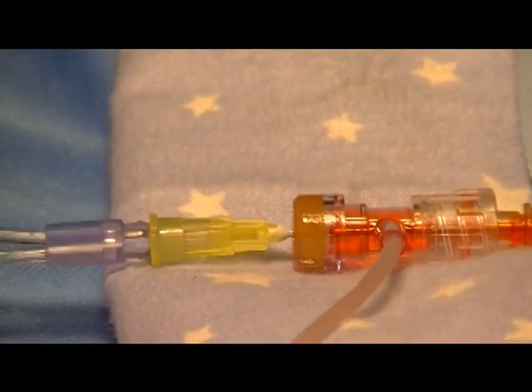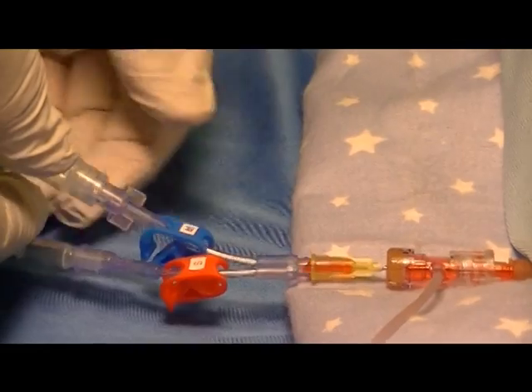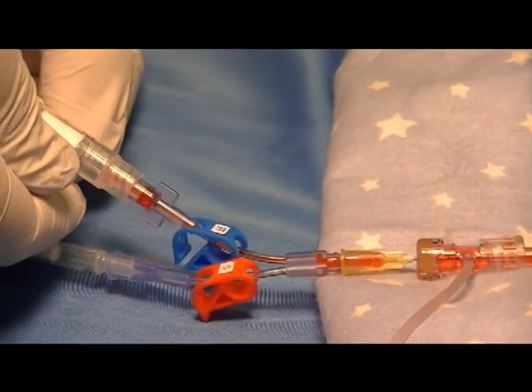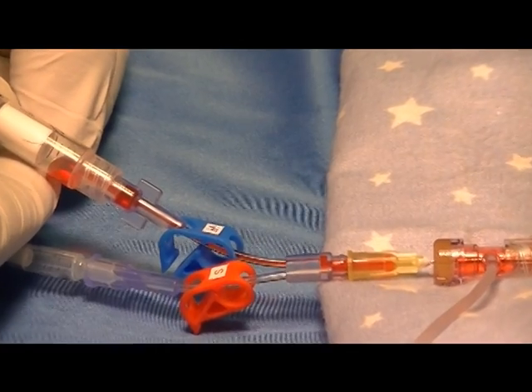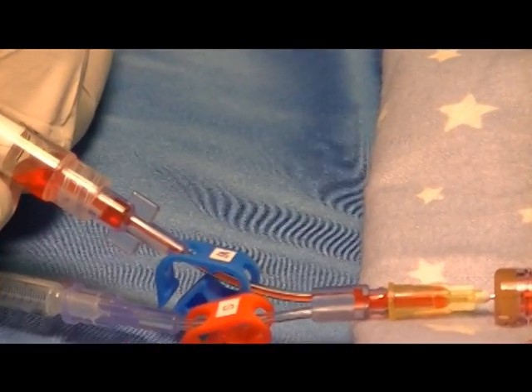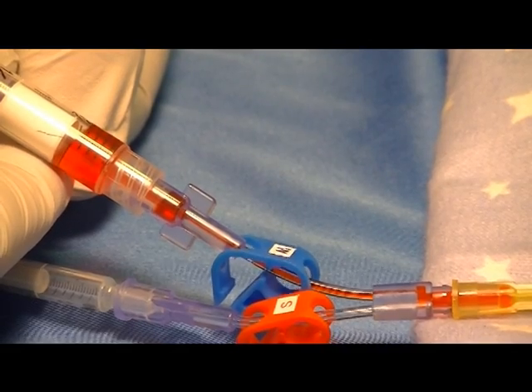Unclamp the waste clamp and hold the syringe at about a 30-degree angle, allowing the waste blood to come into the syringe and push all the air out of the waste.